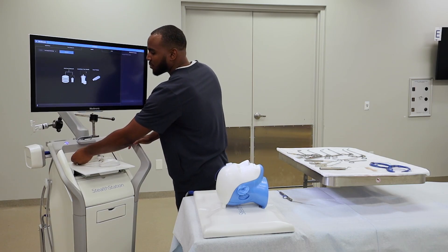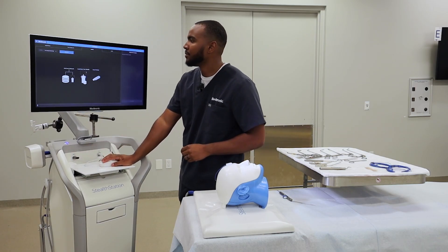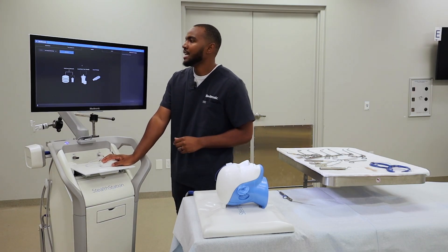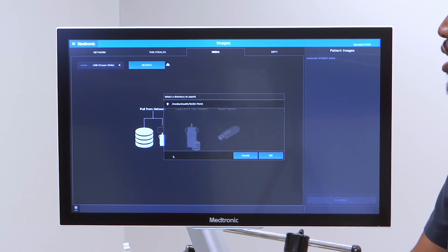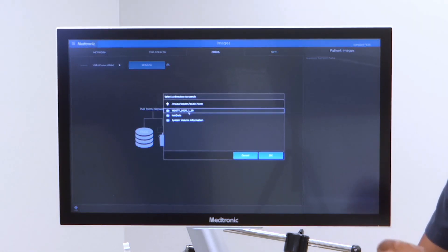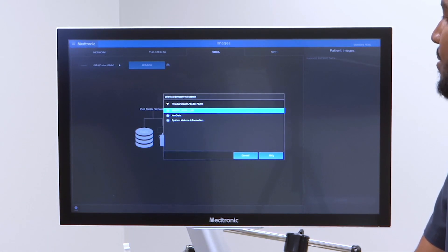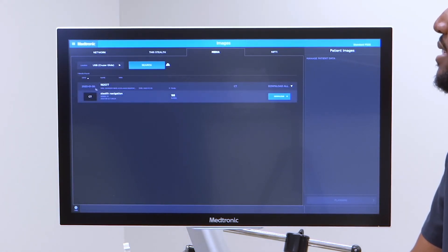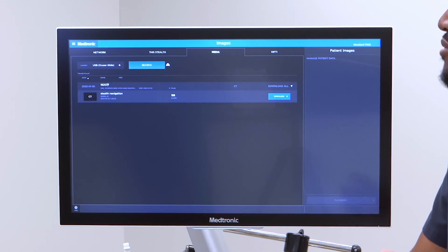We'll put it in the super speed connection there. When it pops up, you'll notice all of the scans that are on the USB drive. I'll click the first one, hit OK, and it'll show you the number of slices as well as the scan name and patient name, however it's labeled.